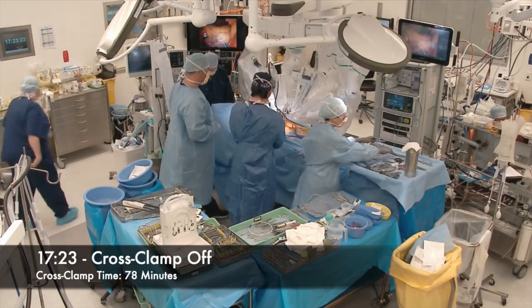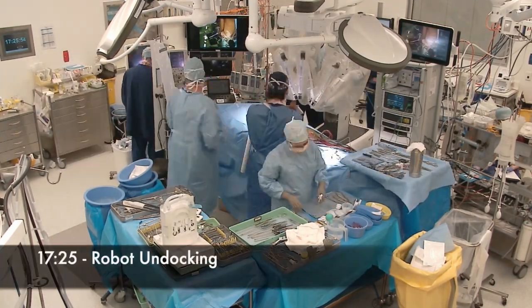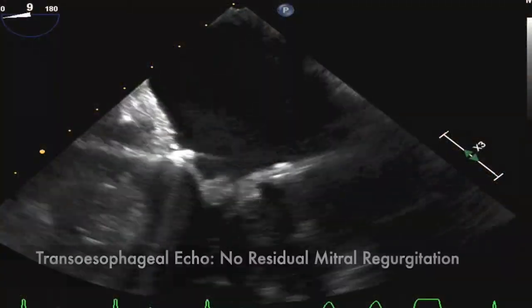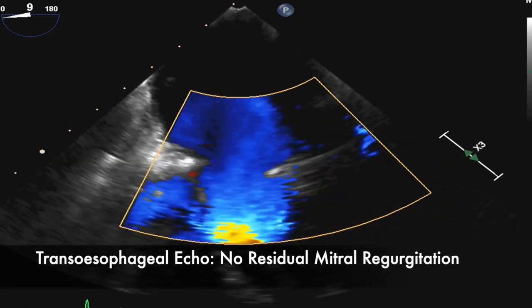Here I scrubbed in for the final time. The cross clamp time for this procedure was 78 minutes. Now is the moment of truth — there was no residual mitral regurgitation.